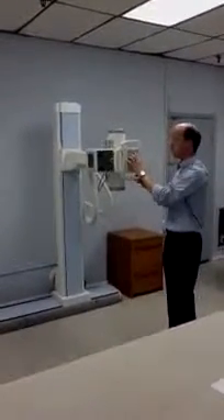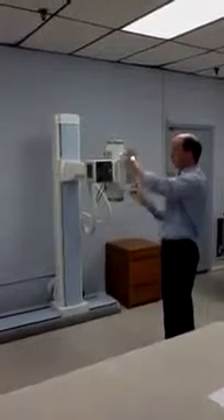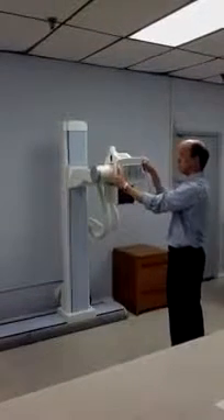The tube stand operates with just a simple push of two buttons for horizontal and vertical, and a third button which controls the roll of the x-ray tube.